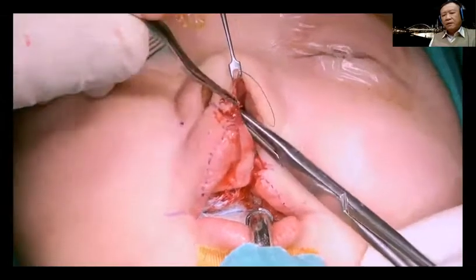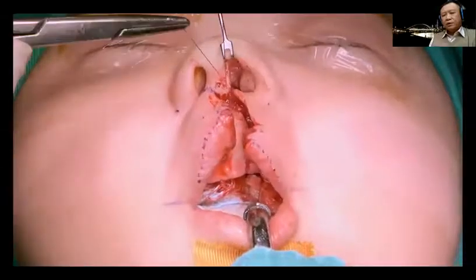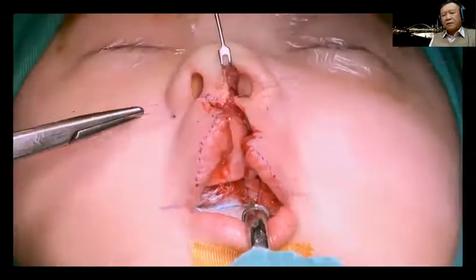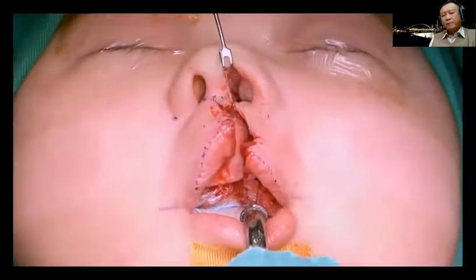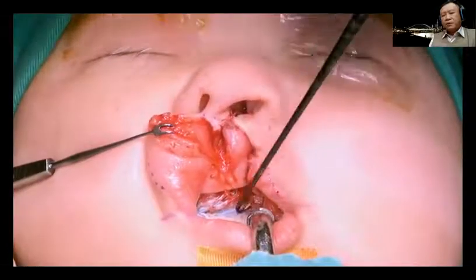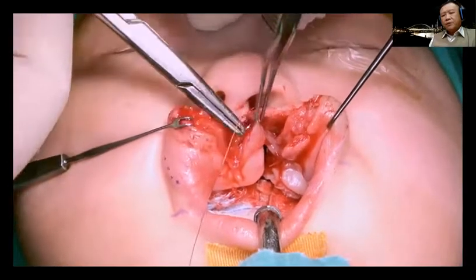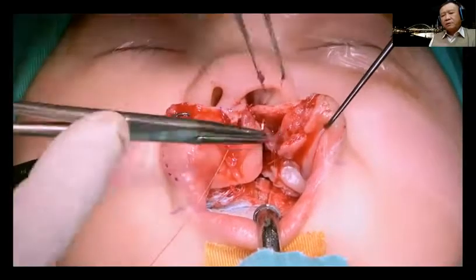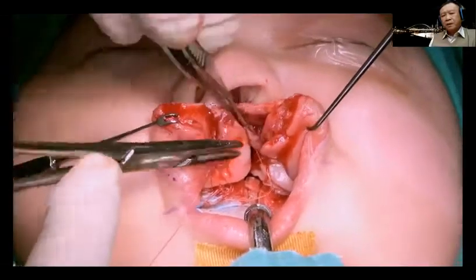This columella base after release can be elevated. So I suture this nasal mucosa here. And this nasal mucosa on the inside is the turbinate flap. And then you see this is a very nice nostril sill reconstruction already. Now I elevate the deep tissue, then I suture the CM flap laterally to the nasal mucosa and the turbinate flap. So this will help to support the nasal floor.